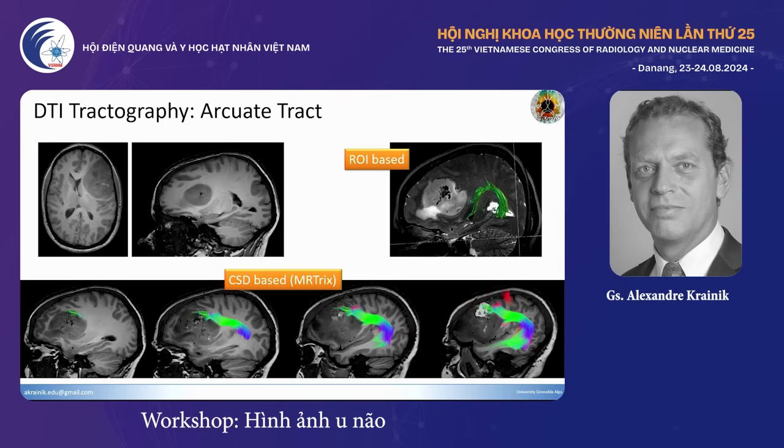Here, obviously, we miss the upper part of the tract, possibly because the tumor avoids the representation or the tractography in this area. And here, it's obviously too large for a tract because it tries to fit the probability to look like the tract rather than depicting the real tract itself.